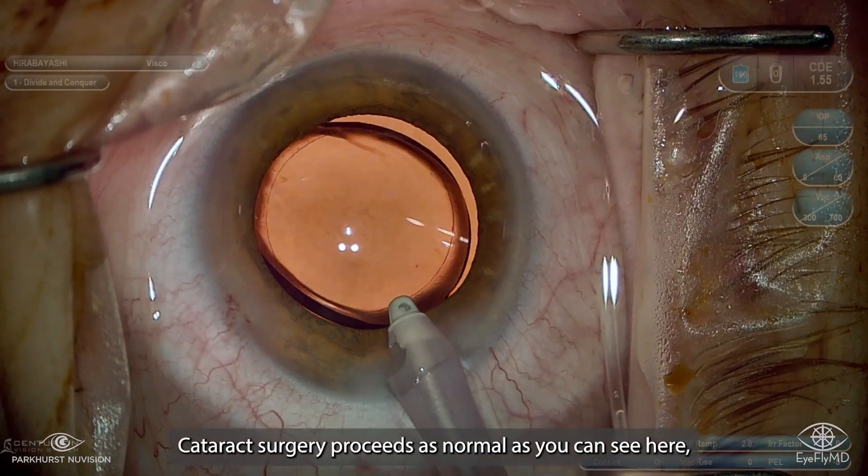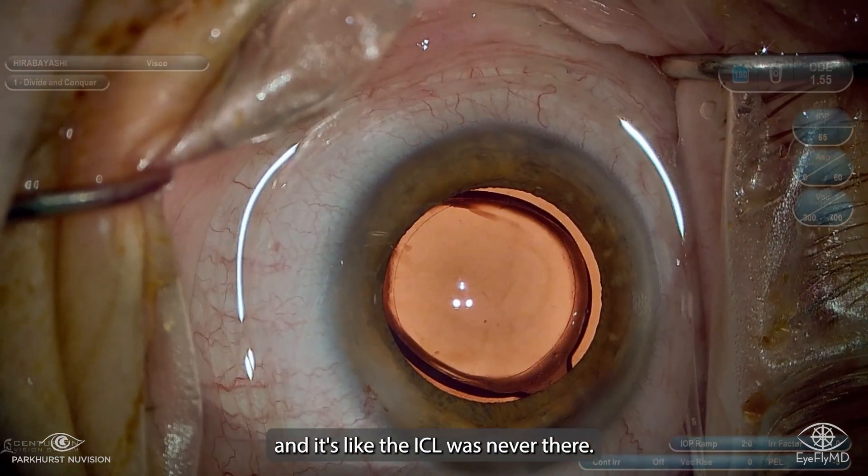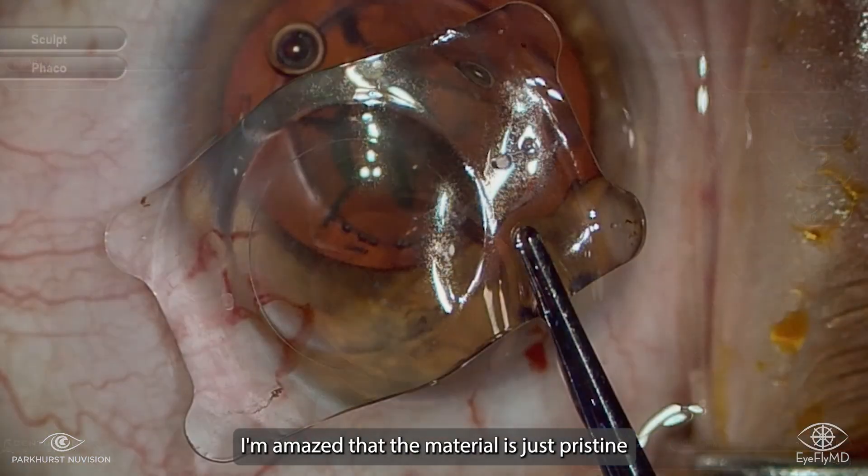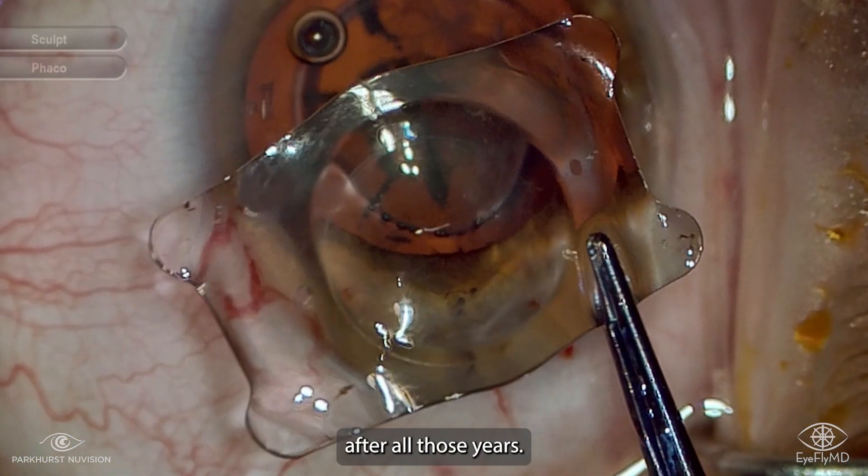Cataract surgery proceeds as normal, as you can see here, and it's like the ICL was never there. So the eye is essentially untouched, and that's the beauty of the technology. And I'm amazed that the material looks just pristine after all those years.